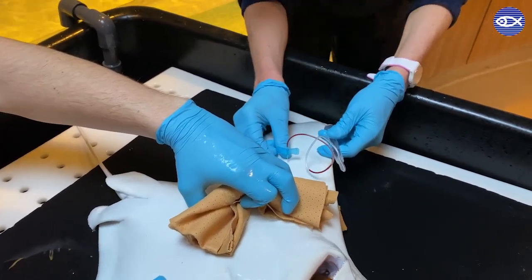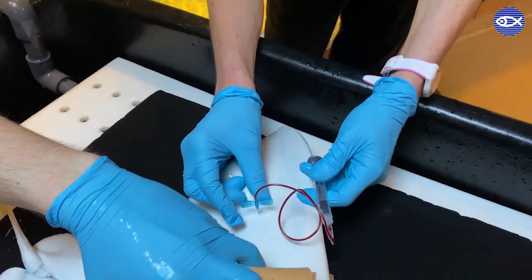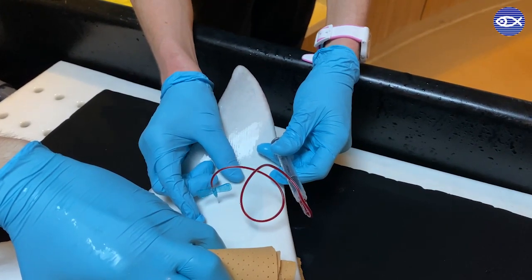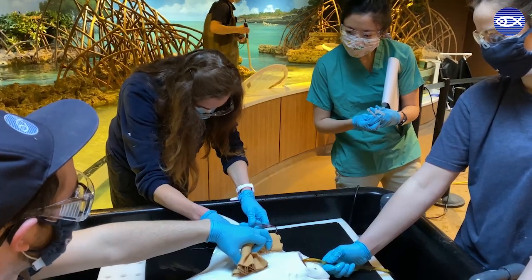For this individual ray, I am drawing blood from one of her wing veins, while veterinary student extern Sam is recording exam notes. Rays have many small wing veins that run along both wings, and these veins are another location where we can collect a blood sample.